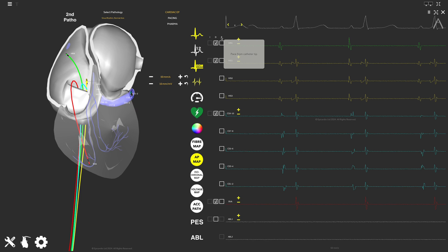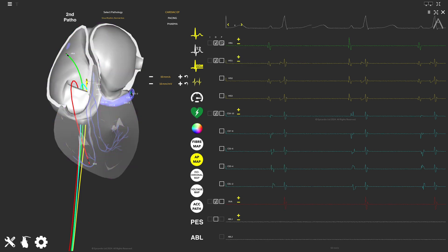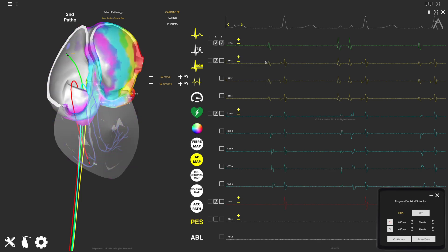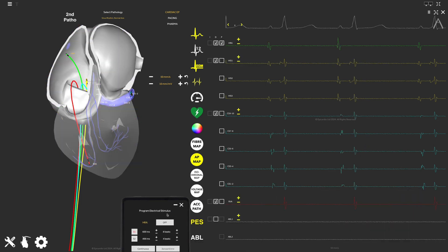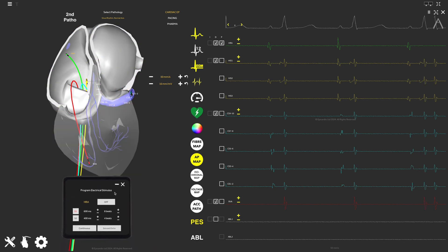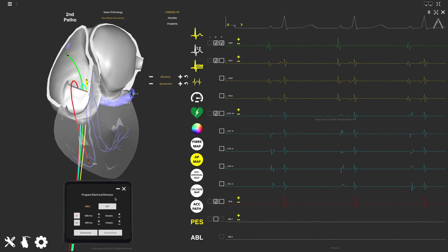Watch the EGM signals from each respective catheter. By ticking any of the boxes under P, you can select which catheter you wish to pace from.